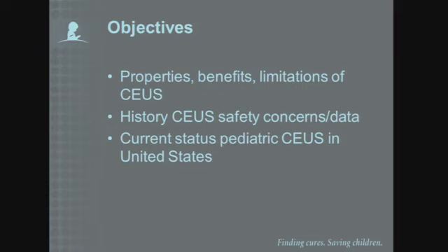I will also discuss the history of contrast-enhanced ultrasound safety considerations and the safety data that is currently available for adult and pediatric patients. And finally, I will discuss the current status of pediatric contrast-enhanced ultrasound in the United States.